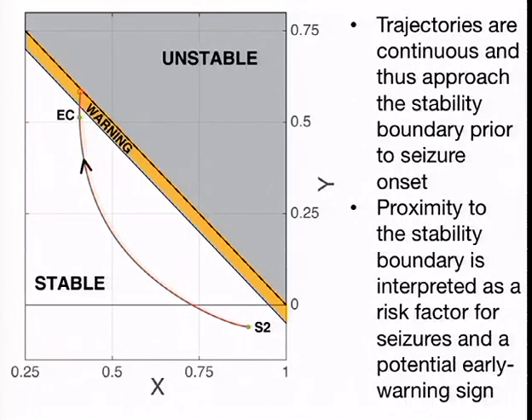Our results are looking quite interesting at being able to use that component of the spectrum to get part of the way to distinguishing REM from the other sleep stages. And in regard to sleep spindles, they actually come out quite nicely in our model because they seem to be primarily an intrathalamic effect, and that interaction between the thalamic reticular nucleus and the relay nucleus seems to be what's most important. And so I think we can do quite a good job of that.